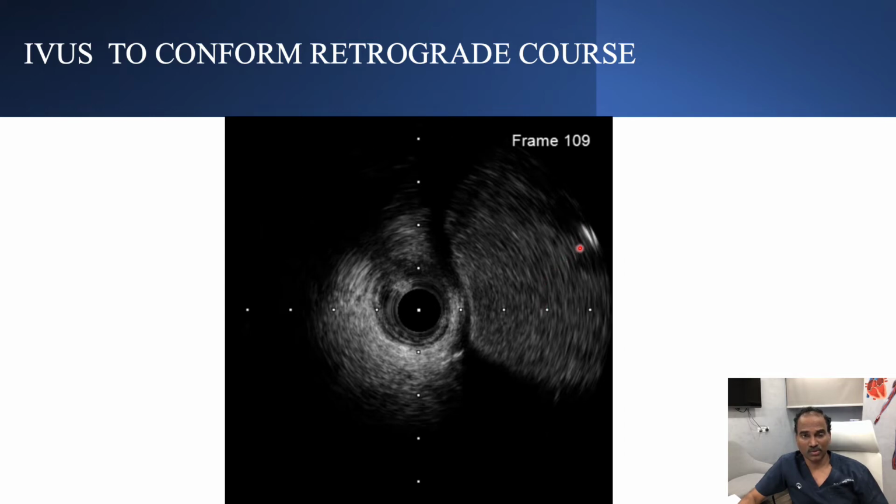How the wire should look is, the wire should be outside the aneurysm. It shouldn't sit within the aneurysm, so it should be in the outside wall of the aneurysm. In this case, this is the inferior side of the right coronary artery, and this is the superior side, where the sinoatrial branch is coming.